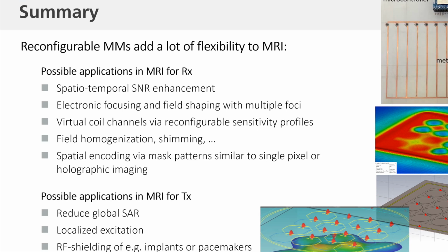Because if you combine this in two different directions, you can get a combination which allows you to get for each individual voxel a very characteristic temporal behavior. And that's something we are looking into right now. There we expect to get a spatial resolution on the order of a millimeter. I don't think that we will get below.